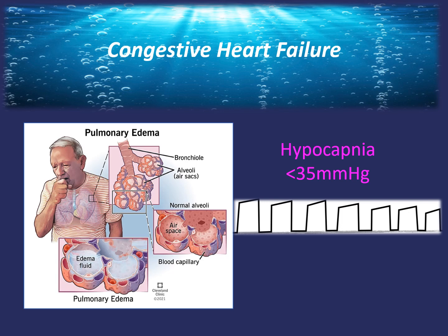End-tidal CO2 will be low due to the decreased perfusion of cardiogenic shock. And we actually have a simultaneous VQ mismatch in most CHF patients, because of the tachypnea as well as the decreased perfusion.